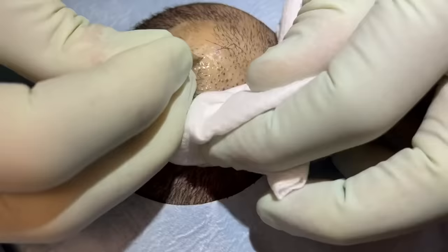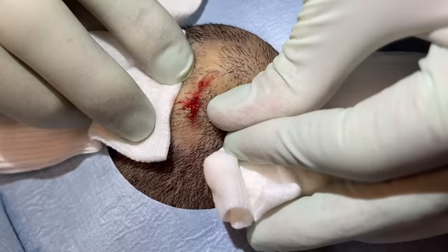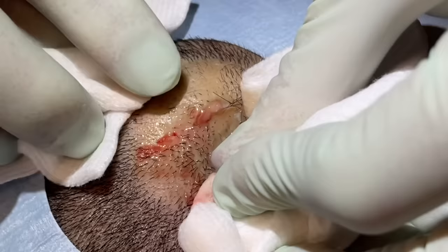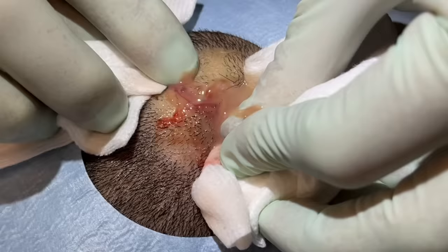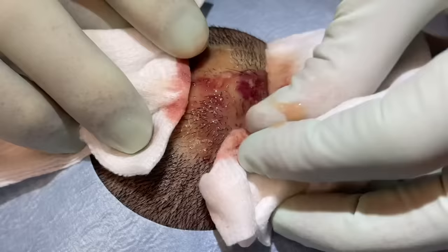There we go. Let me just hit the pocket right there. Good, and because this one's not real red, he doesn't have a ton of fluid — not a ton of pus. There's a different pocket you can kind of see here. Not bad? You're okay? Yeah, I'm okay. Good. So what we do with these — can you get me a blunt loop extractor? Okay, I'll have one over there.